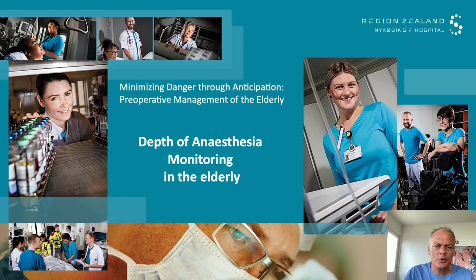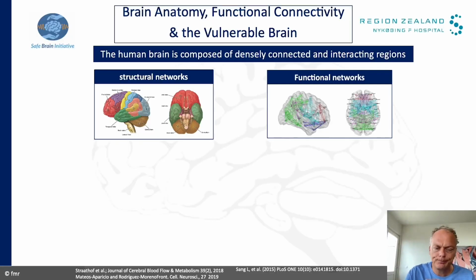It's my pleasure to be talking about depth of anesthesia monitoring in the elderly patient. When you look at the brain structure, we can, as we all know, distinguish two parts: the structural network and the functional network. The structural network is basically the anatomy. The functional network is how the different areas are communicating with one another, which they're doing at all time phases.